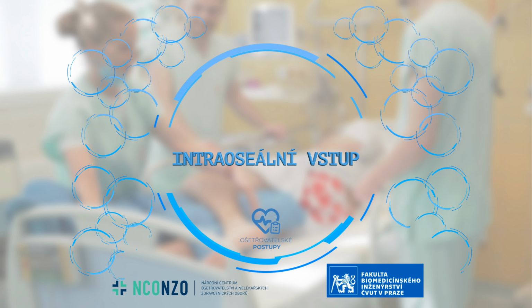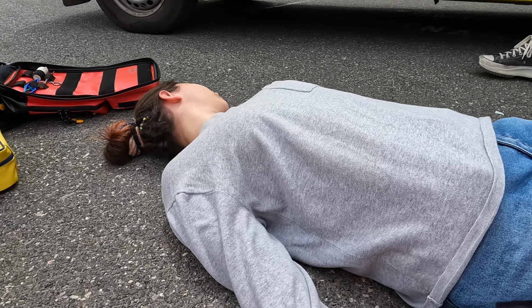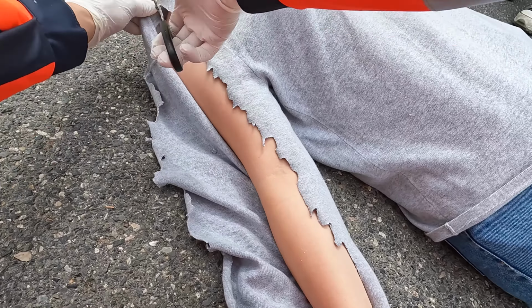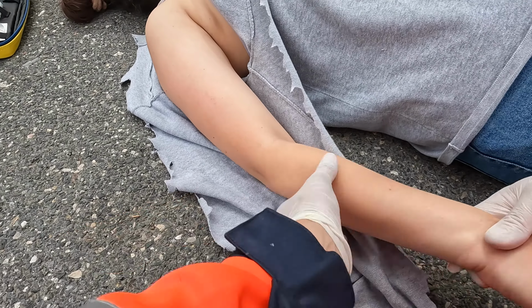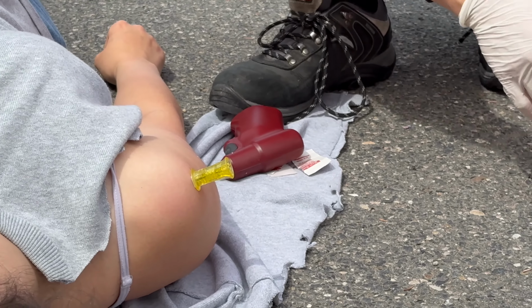Intraosseous access. Intraosseous access is an alternative method for securing access to the vascular system, allowing the administration of medications through the vascular system in the bone marrow. Unlike venous access, the bone marrow network does not tend to collapse. Due to its rapid and relatively simple placement, it is most commonly used in pre-hospital emergency care or in military medicine.